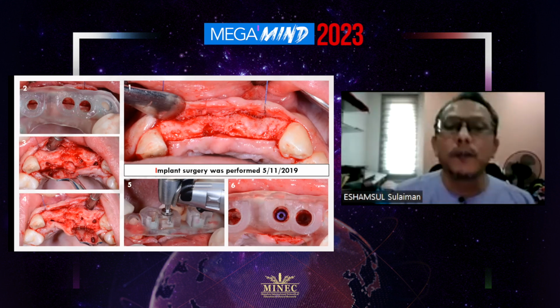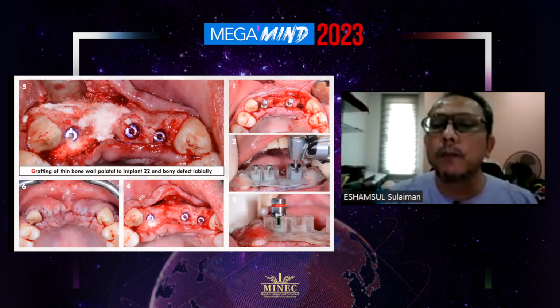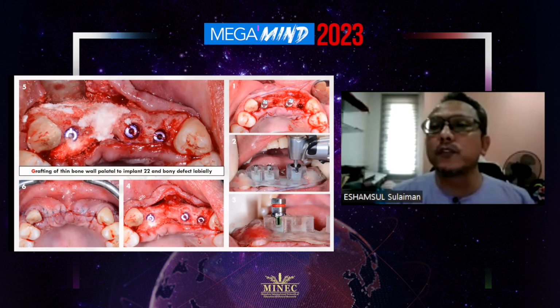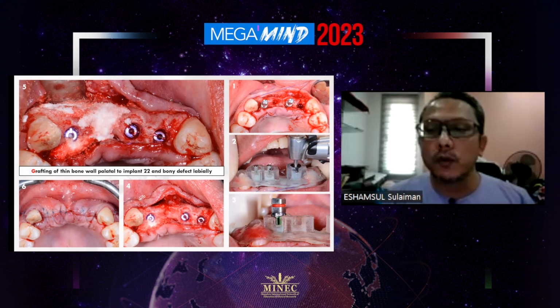Following that, fully guided implant placement was done for all of the 3 implants. You can see in the first picture here that parallel pins were also placed to further ensure the parallelism of the implants. The protocol for fully guided implant placement using the R2 drills and R2 guide was followed.